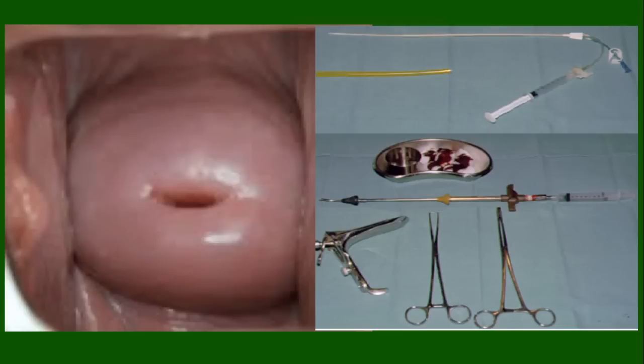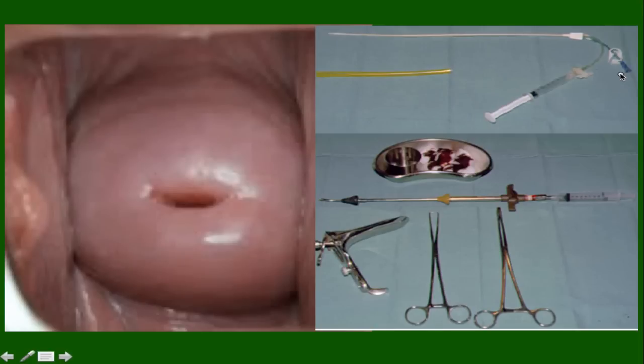After confirming that the patient is not pregnant nor bleeding, and after obtaining informed consent, the patient is placed into the lithotomy position and a speculum is placed into the vagina. You can see a picture of the woman's cervix. The cervix would then be swabbed with betadine, and a catheter or cannula would be gently placed into the cervix or uterus. The other instruments include a single-toothed tenaculum, which can be used to grasp the cervix to help with positioning.